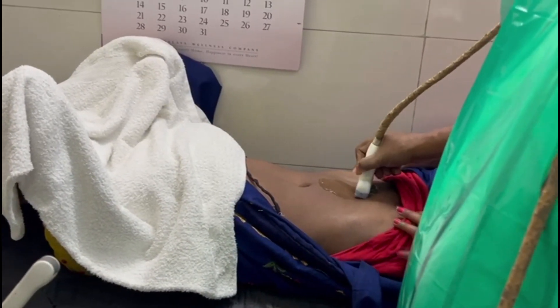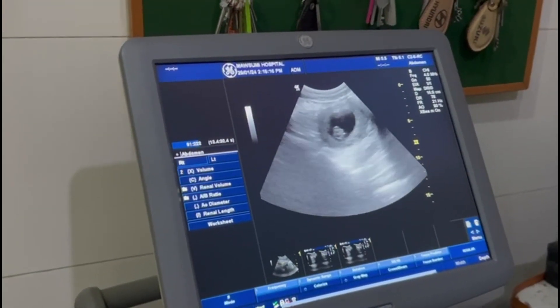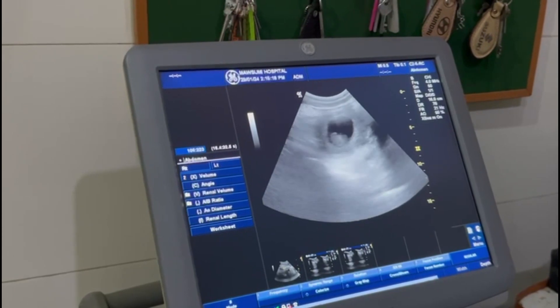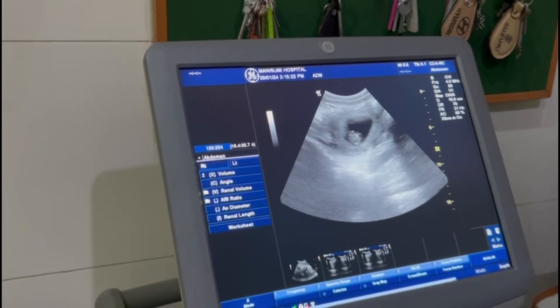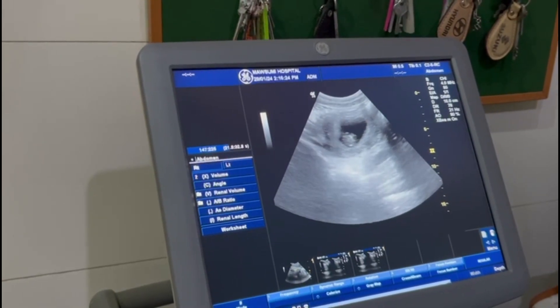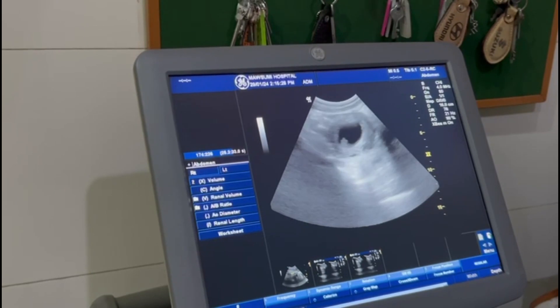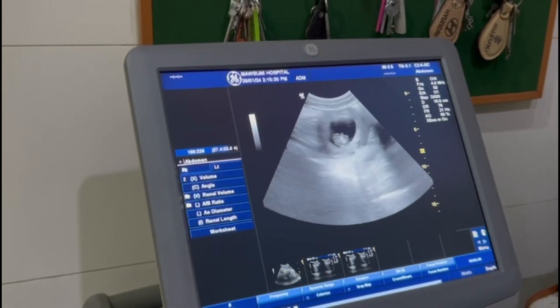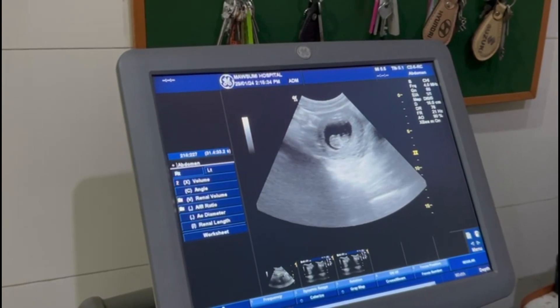Only sac — see, it is a very small baby. The sac is visible; it is the gestational sac. It is a very small baby. We shall measure the gestational sac and crown rump length.